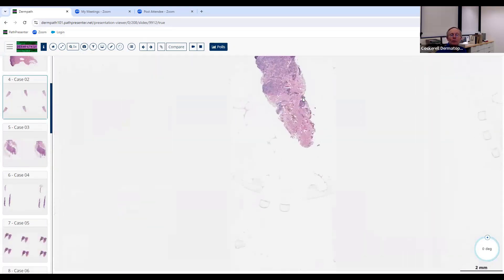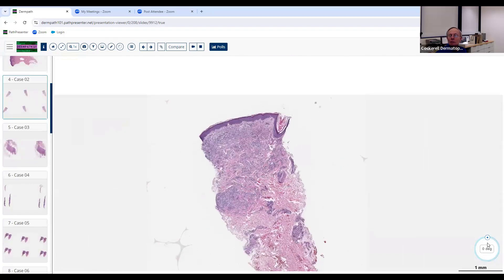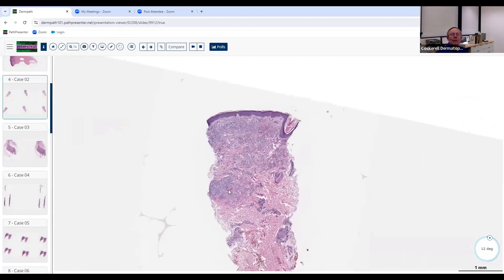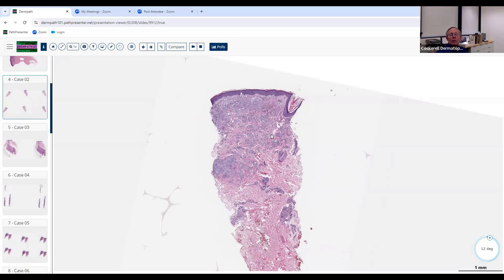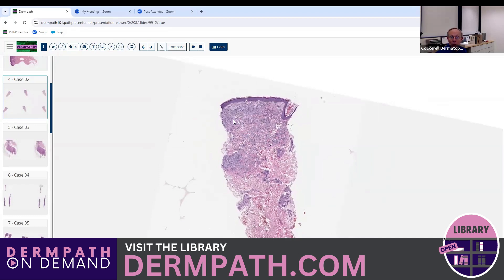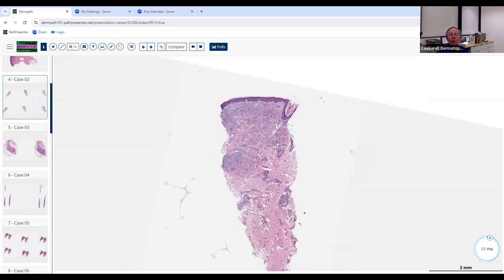This next case is another punch biopsy. At low magnification it looks totally different from the last one. The process is confined mostly to the dermis, and these cells at low power look really pale. When you see something pale at low magnification that looks inflammatory, you should think it may likely be histiocytes. I'd probably say no epidermal involvement, cells are between collagen bundles, they're pale — my first diagnosis would be granuloma annulare.